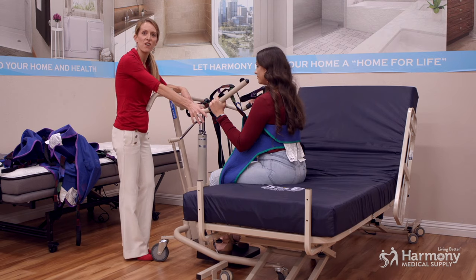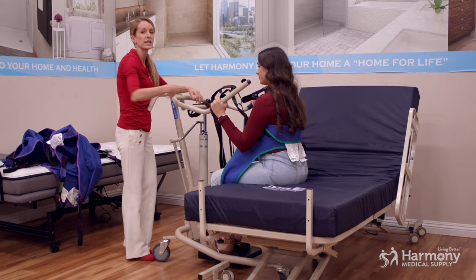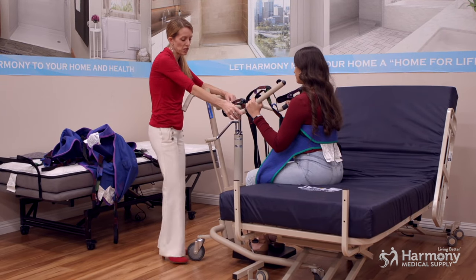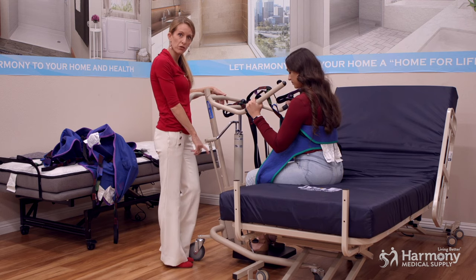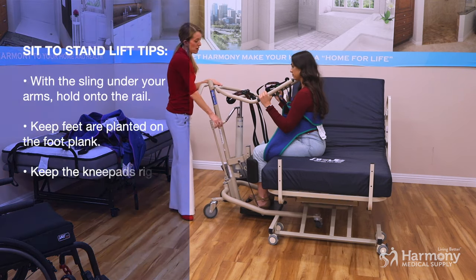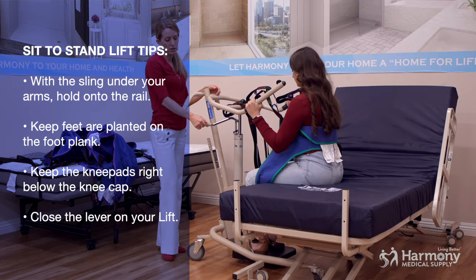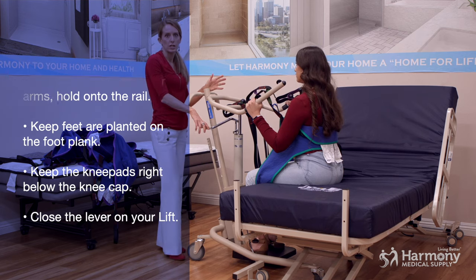Now that the sling is on, have them place their arms around the sling with it going up under their arm and hold on to the rail. Make sure they've scooted far enough in the bed or chair so their feet are on the foot plate, and that the closed lever on the hydraulic lift is closed so it will go up when you do the lever. Also make sure the knee pad is in the right place — right below the kneecap — so it's not hurting their kneecap when they're coming up.